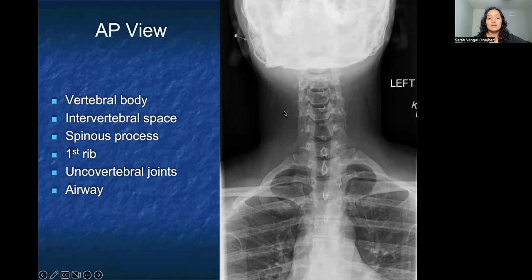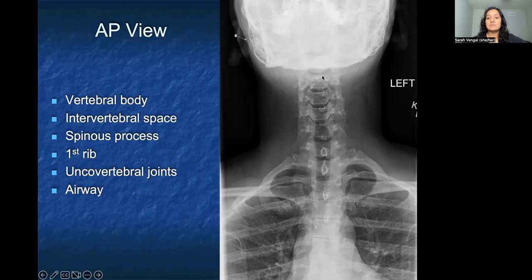The uncovertebral joints are also helpful to look at — these are the posterior lateral corners of each vertebral body and help with the movement of the cervical spine. In this view, you can also see the patient has a very patent airway, which is why you see this radiolucency overlying the cervical vertebral bodies.